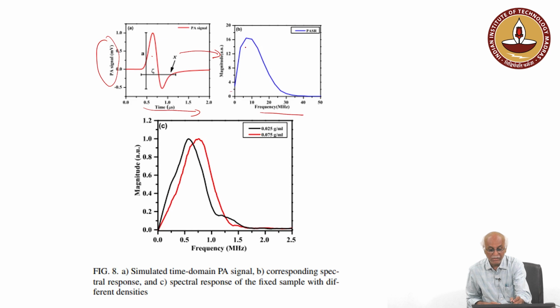If we see the frequency distribution, it is of the order of a few megahertz or sometimes a few hundreds of kilohertz, depending upon the type of tissues, etc. This is just a simulated signal, just to show you how.